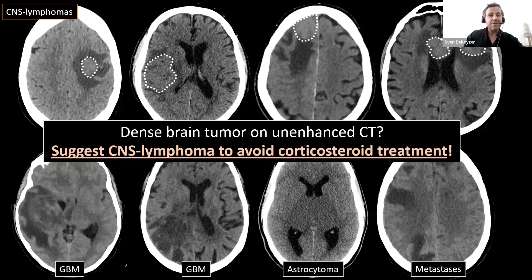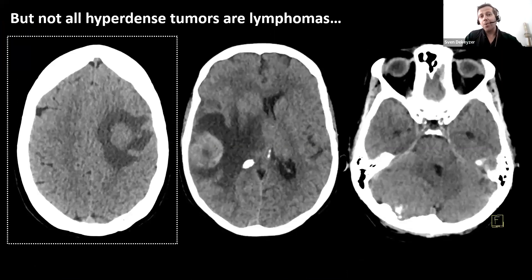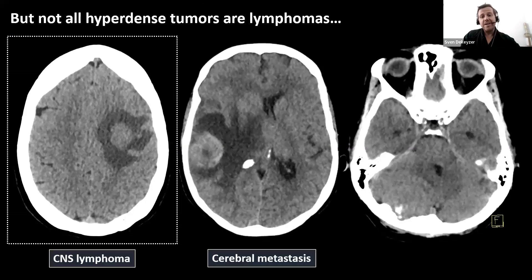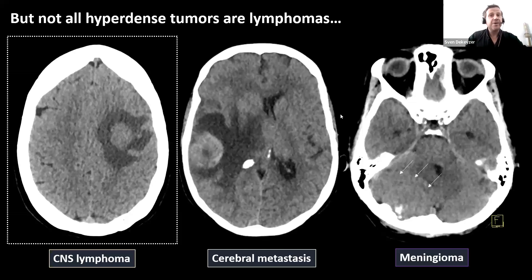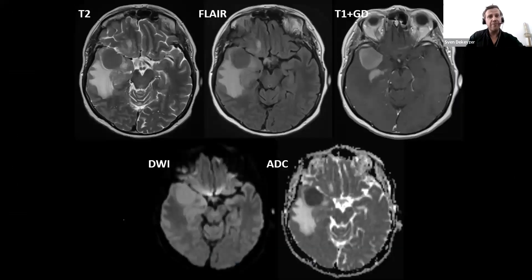Not all dense tumors are lymphomas — you can still have hemorrhagic metastasis that are dense on CT. An unenhanced CT is not diagnostic, but if you see a dense tumor, you should suggest the possibility of CNS lymphoma. After that, the patient will receive an MRI.